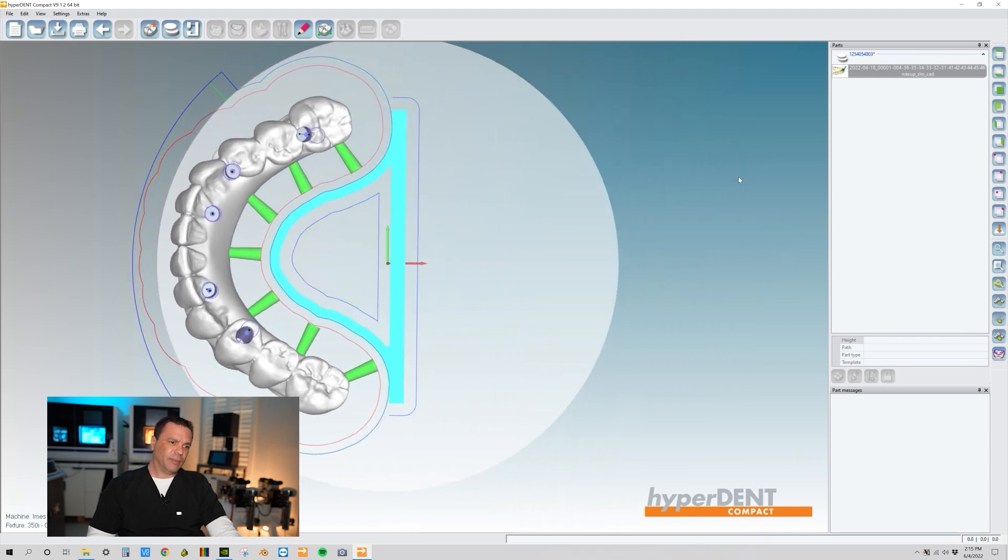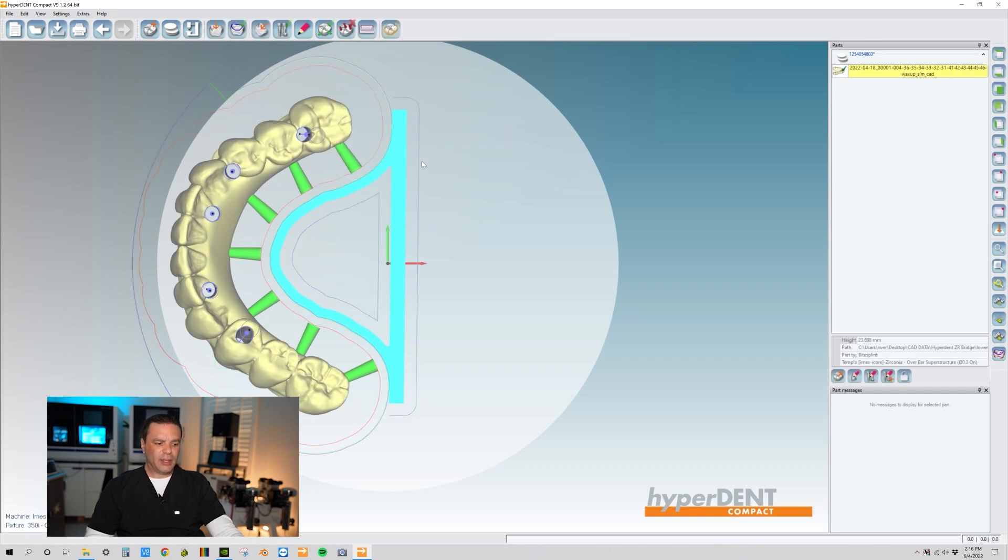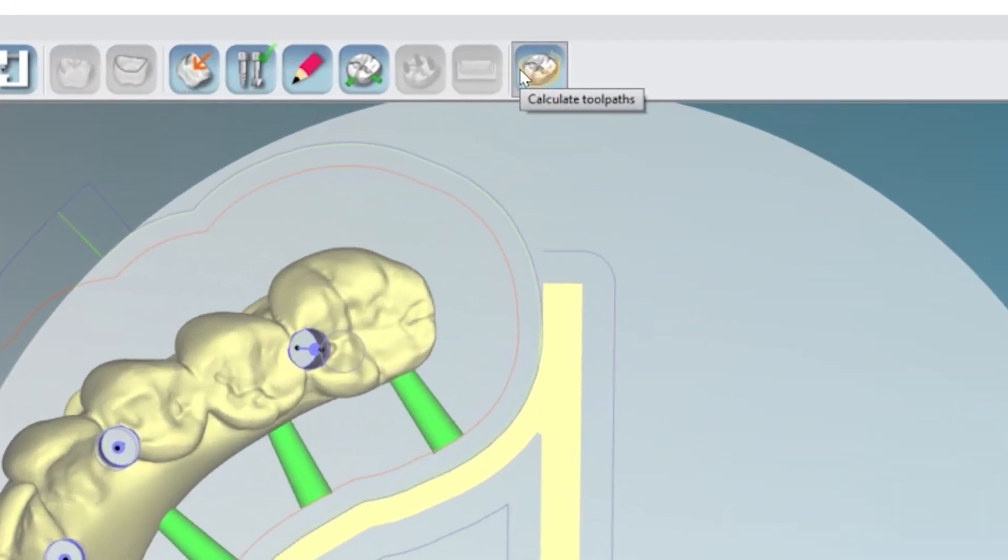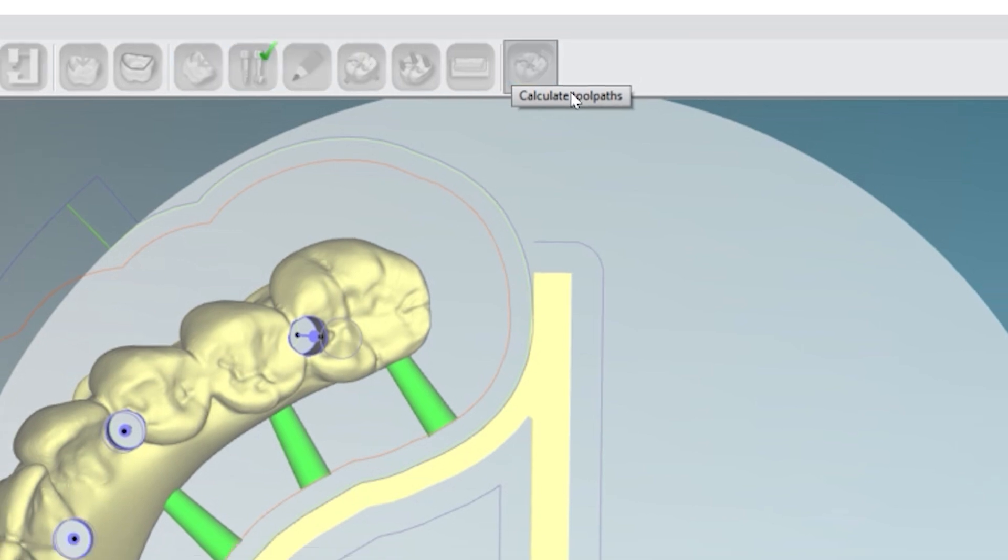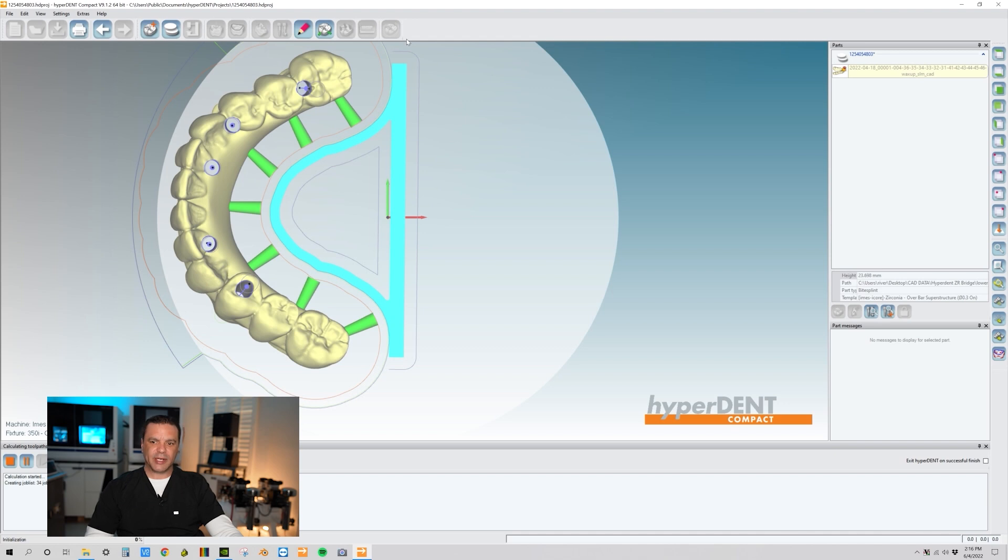Perfect. So this is done. Now our next step is we want to highlight the part. And then what I like to do also is hit control and then highlight the centering frame. Come over here to calculate tool paths. All right. We're ready to go.